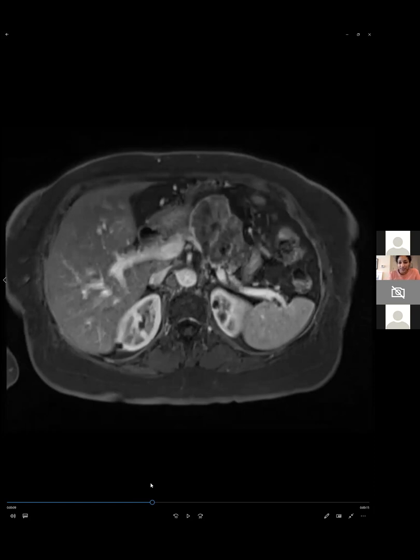Alina said, did you discount colloid pancreatic ductal adenocarcinoma variant based on the T2 signal? Ross is dodging your question. Oh, yeah, I haven't seen one. I know it exists. I just have never seen one, so I want to know what it is about this that made you discount that. I guess just what we felt was the classic appearance plus the MRCP and everything else that made us think that it was just benign SCA.